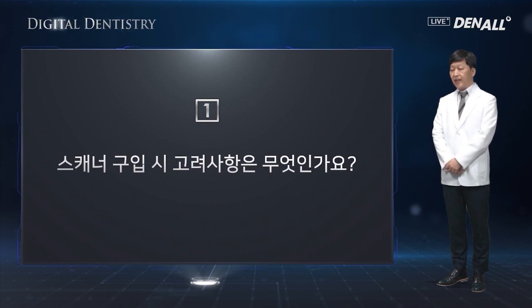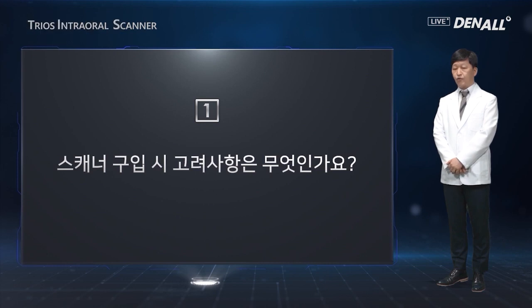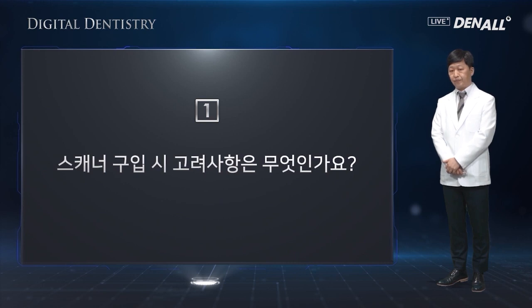When you purchase a scanner, if you think you just do the scanning and the rest of the work will be done by a lab which doesn't have any problem in using the image that you scanned, then you don't need to buy an expensive scanner. But if you want to do the design work yourself, you need to buy an intraoral scanner which can do the designing work very well.